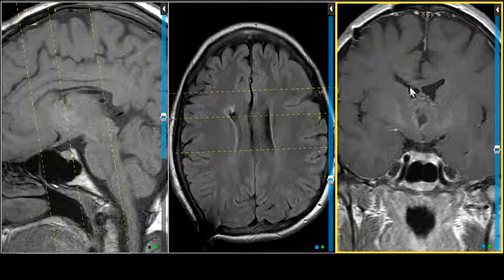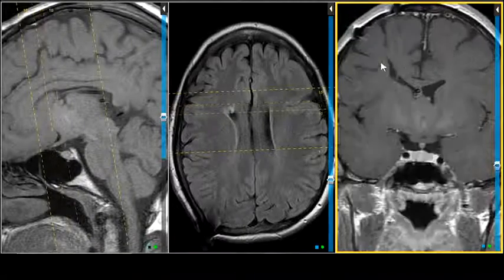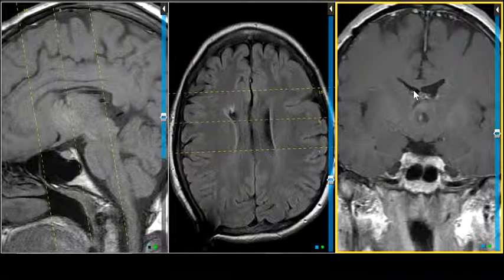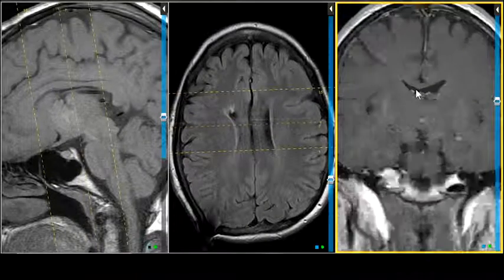It's going to be very hard to reach by this approach, so I don't know how successful it was. Now, there's actually two approaches you could take to the ventricle. One is this transfrontal, which is what happened here. The other would be transcallosal, which actually might have given you a little better shot at this tumor. So you can see they didn't get it out. Now, I don't know, maybe there was some here before.